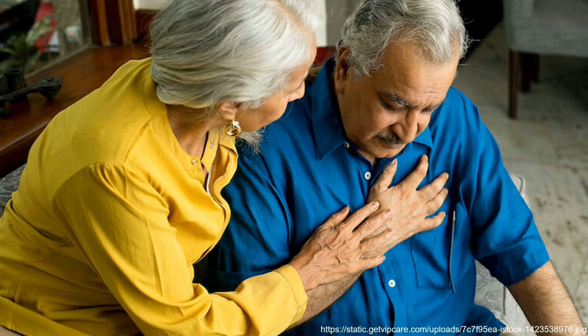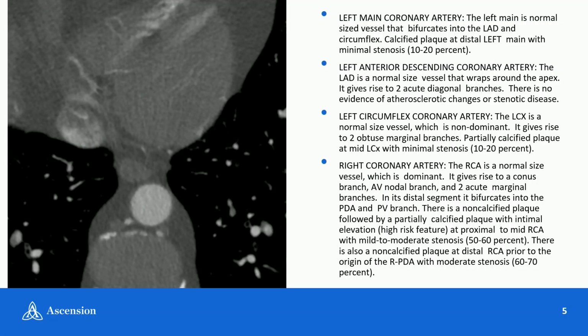So in the ISCHEMIA trial protocol, in addition to titrating medical therapies and making sure that they are on antianginals, and obtaining an event monitor to make sure these seizures aren't his heart stopping for periods of time, I requested a CCTA to definitively evaluate. I don't read CCTA, but we have a great group of readers at our institution who provide us the clinical support to get these studies done and then work together to figure out what it means. And because I'm not a reader, I don't have great axial views or MIPs for you to look at, and I apologize for that.